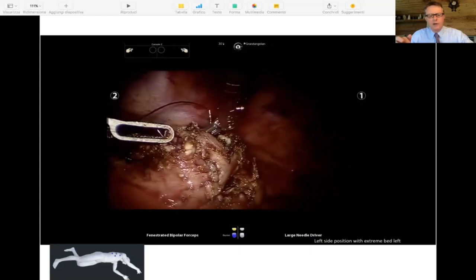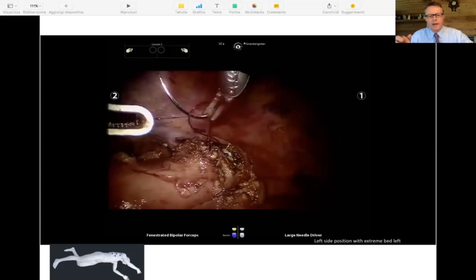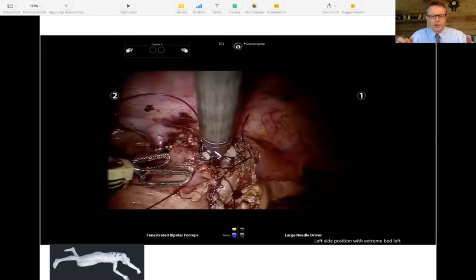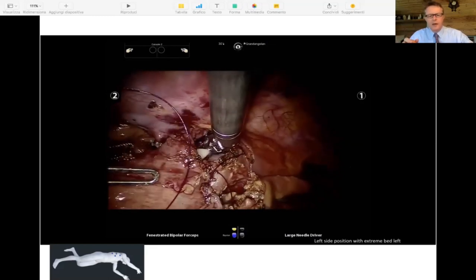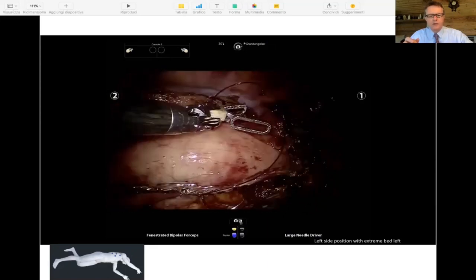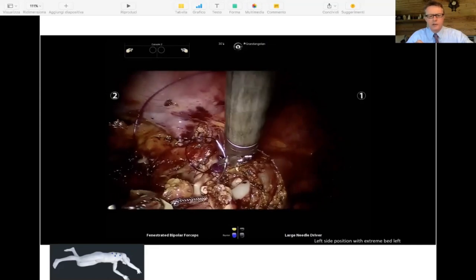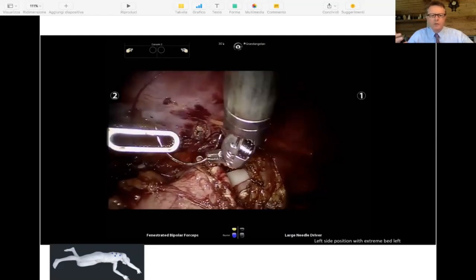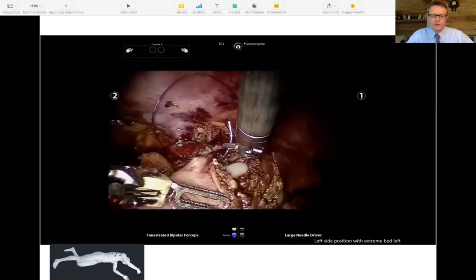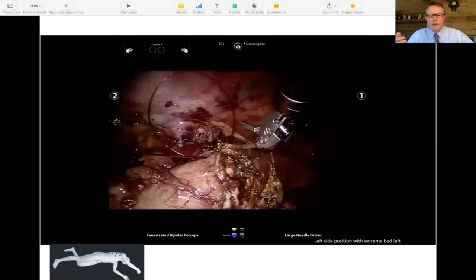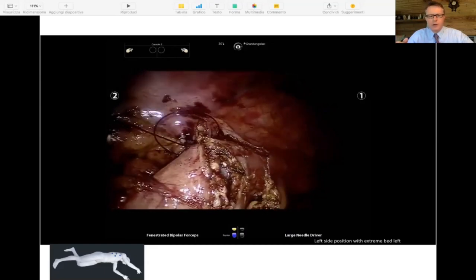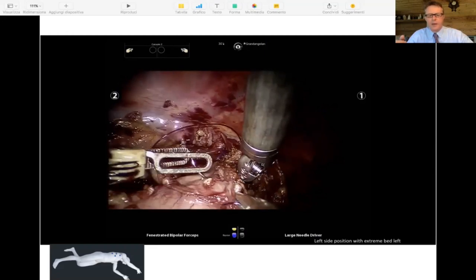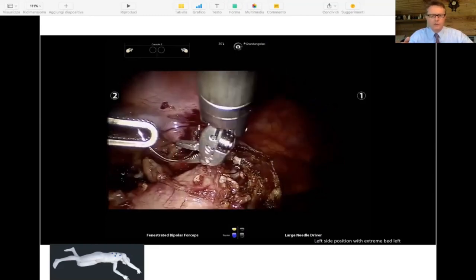This is the internal posterior layer of our anastomosis, which is then followed by the anterior layer. The NG tube is passed by the anesthetist from the esophagus to the gastric conduit. The reason for the gastric tube is to avoid any extra inflation of the gastric conduit, which would place extra tension on the anastomotic line for the first couple of days after surgery. We usually give methylene blue to the patient on the third post-op day to make sure there are no leaks, and then start feeding the patient with a fluid diet from the third post-op day.